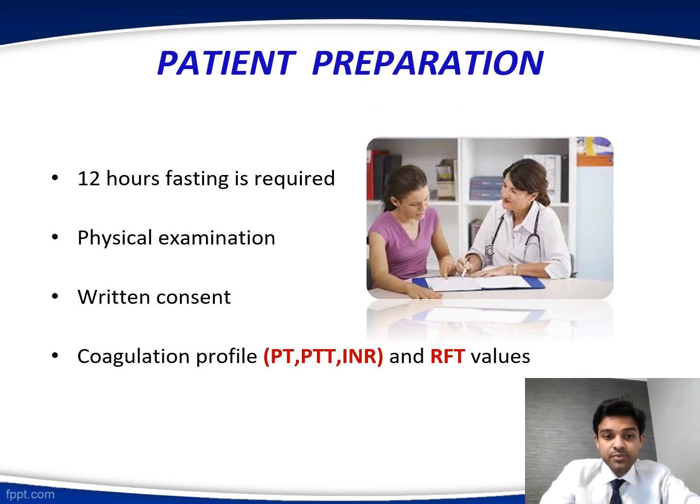Now let us take a look at patient preparation. 12-hour fasting is required. So why 12-hour fasting is required is, in some institutions, they do the procedure under general anesthesia. So if the procedure is done under general anesthesia, 12-hour fasting is required. If it is not done under general anesthesia, 12-hour fasting is not required. Then physical examination is a must. Written consent, the patient should be informed of what kind of procedure has been done to him, and also the complications that thereafter might add on. Coagulation profile, PT, PTT, INR, and RFT values also are taken.